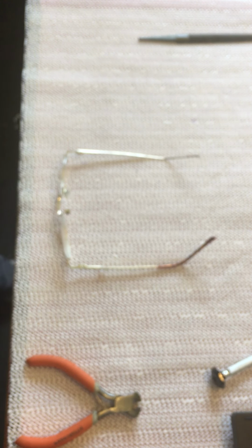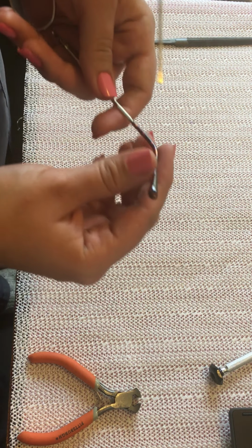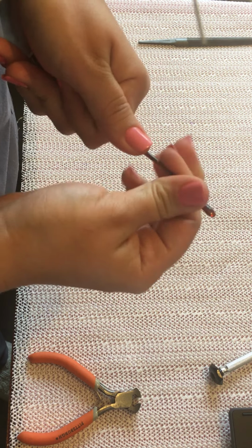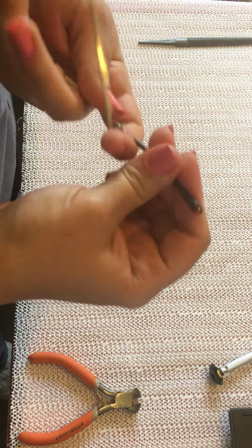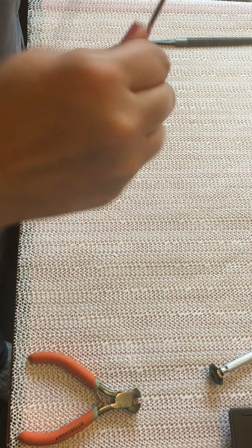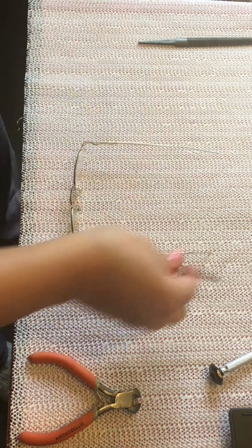Okay, so in this frame, I already removed one on this side, okay? And the way to remove it is just basically, we heat it up. I don't have anything to heat it at the moment, but we could heat this up. We bend it, we straighten the back bend out. Okay, not too much, but we straighten it. Then we just wiggle it out. There, we wiggle it out.